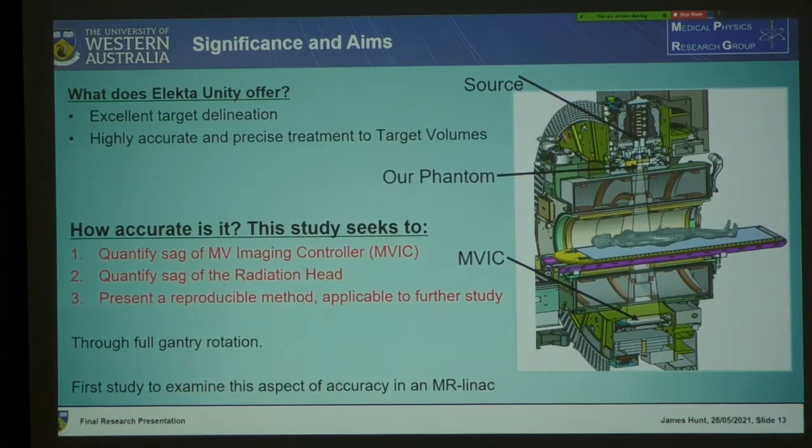There have been a couple of studies that have examined positional accuracy of the treatment beam at cardinal angles, but not through full gantry rotation. So mine is the first study to examine accuracy to this extent.